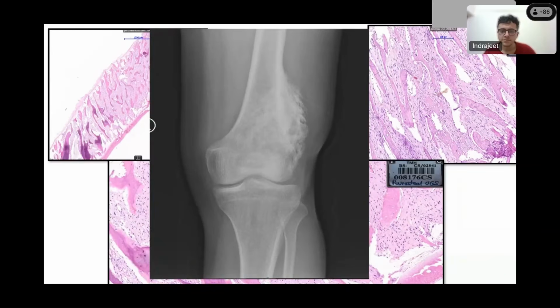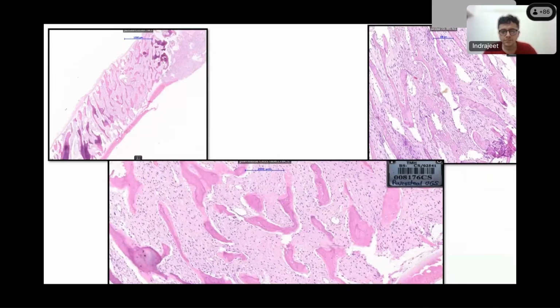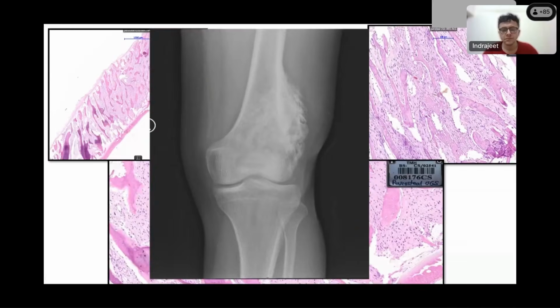Right. So Prakash, I haven't put a lot of cross-sectional imaging in this case. No problem. To carry forward, this morphology fits perfectly with that imaging, which is that of a surface osteosarcoma. And which variant is this? This is a parosteal osteosarcoma. Yeah, okay, this is a parosteal osteosarcoma, which, if you look at it without any context, looks literally like a benign lesion. And that is what I kept repeatedly saying, that unless you know the spectrum of all the conditions that happen, you won't be able to make these diagnoses.